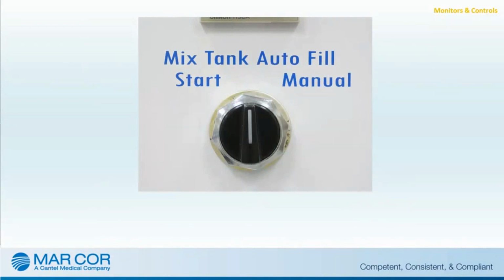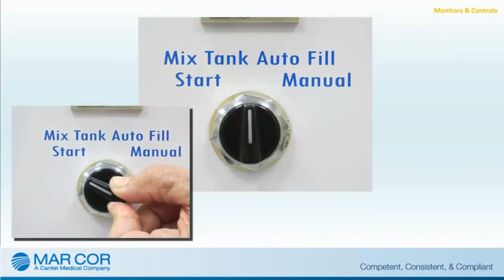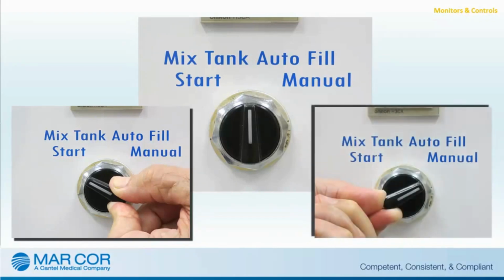The mix tank autofill switch is a momentary switch that initiates automatic or manual filling of the mix tank. When the switch is moved to the start position, the fill timer and solenoid are activated, filling the mix tank for the duration set by the timer. When the switch is held in the manual position, the solenoid is activated, allowing water to flow into the mix tank as long as the switch remains held in this position.